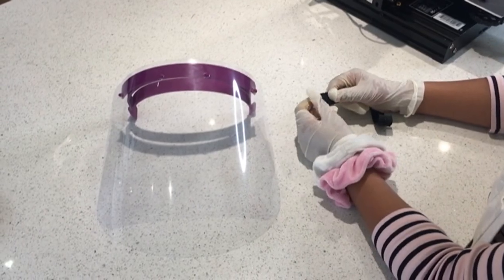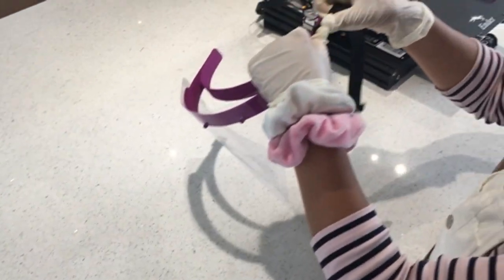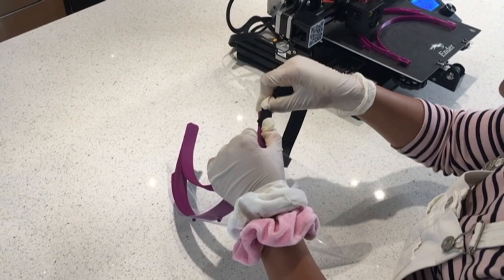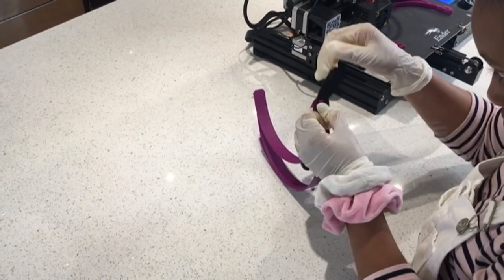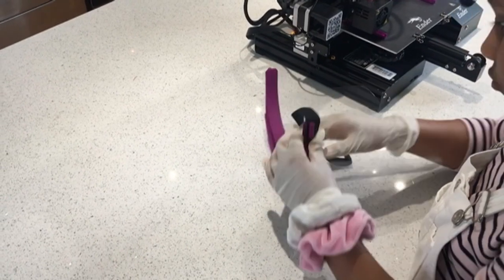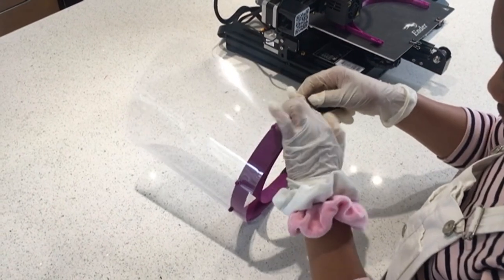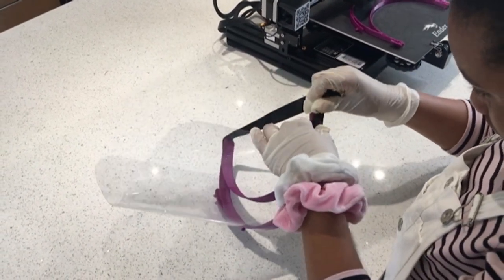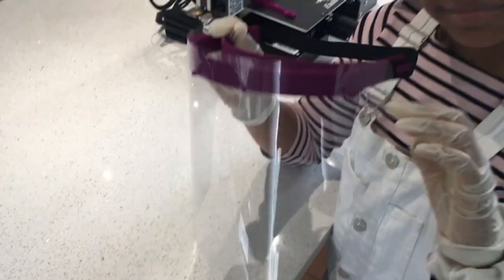Finally you need to attach your elastic to two small hooks at the back of your visor just like this, and there you go, there's your finished result. And this is how they're worn.